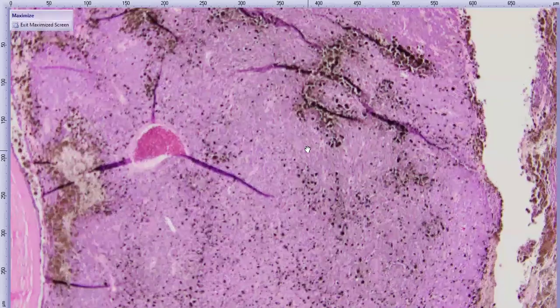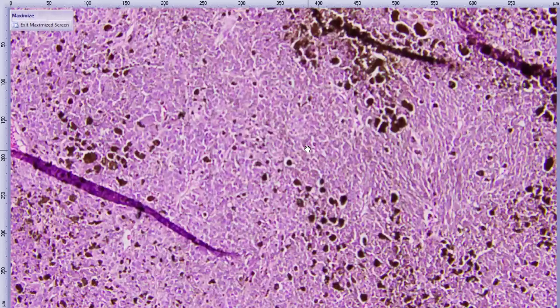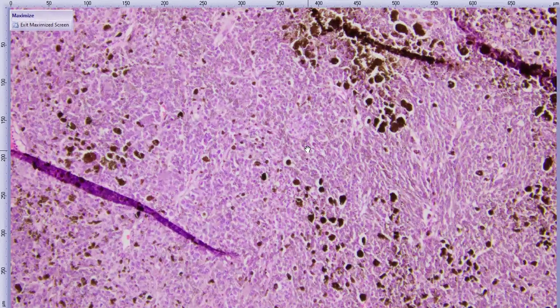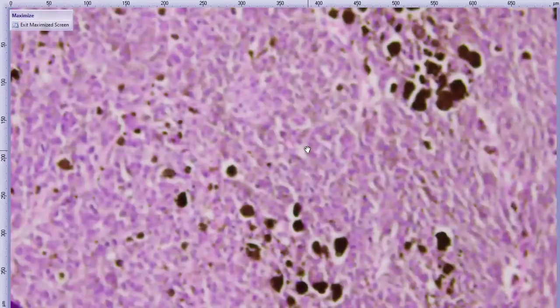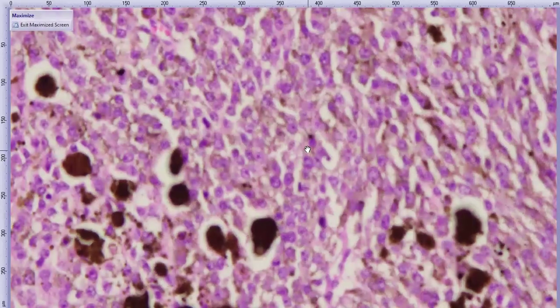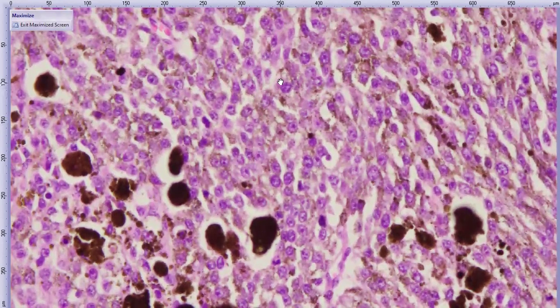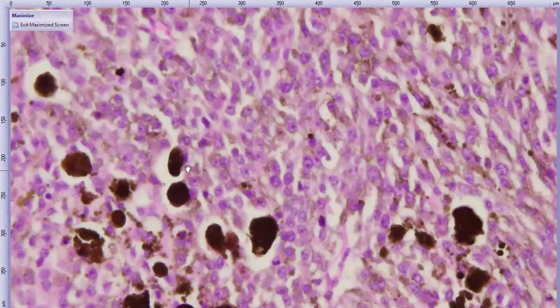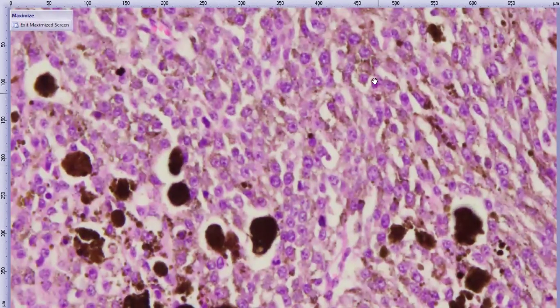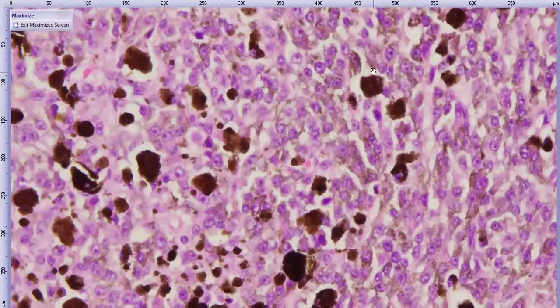And we come in and look at the cellular infiltrate here. We can see, again, a partially pigmented population of what are neoplastic cells. A lot of them are polygonal, but there's also some that are spindle cell in here. It's nice to look at these not so pigmented neoplastic cells to get a good look at the nuclear features, because in these big polygonal ones, it's often obscured by all the pigment. And so the nuclei are kind of round oval, finely stippled chromatin, maybe indistinct to one nucleolus.